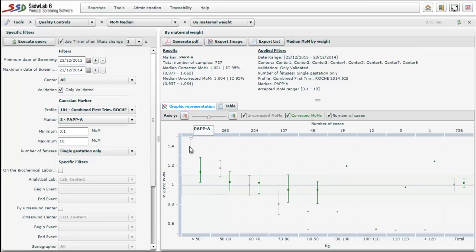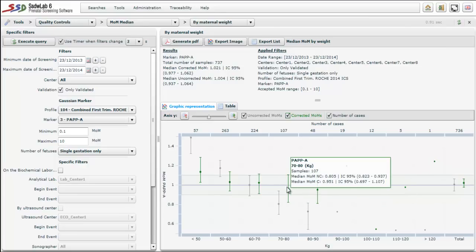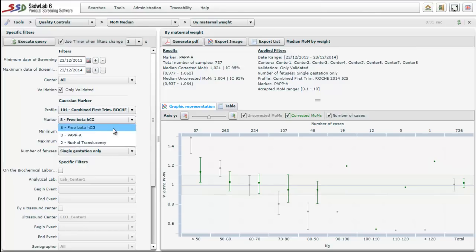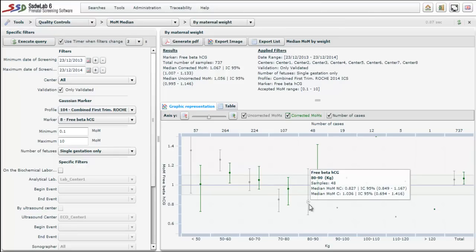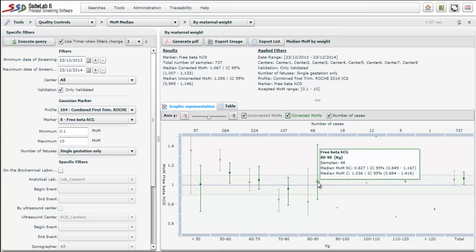The median MoM corrected by weight and other factors tends to correct this but still falls outside the limits. For weight intervals above 70 kg, the median uncorrected MoM is outside the limits, but now we are underestimating. However, the median corrected MoM value is inside the acceptable range. If we assess the median MoM for free beta, we observe that in low weights the median uncorrected MoM is off the limits, overestimating its value, and for high weights it is also outside the acceptable range, underestimating. But we can observe that the correction works, because the median MoM corrected by maternal weight and other factors is inside the appropriate range.